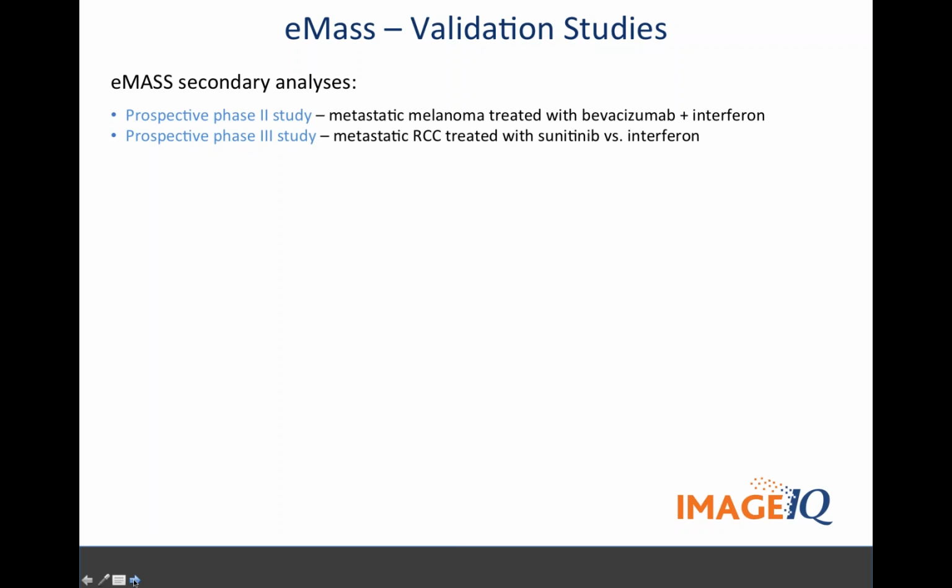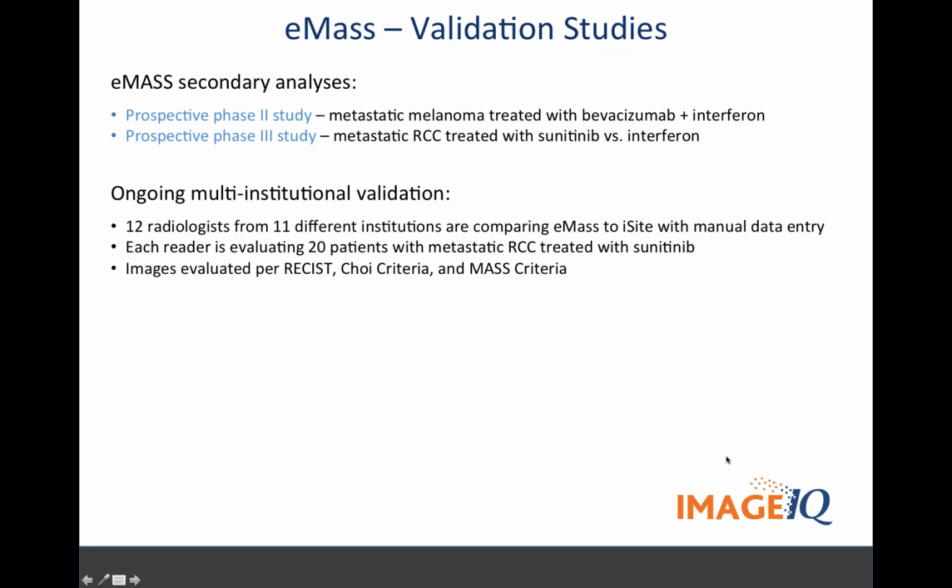We were able to do a secondary, retrospective analysis of that with our software and look at a number of different tumor metrics. That's where our vascular tumor burden really shines, very predictive of outcome. I would argue that's currently the best biomarker in existence for predicting response to anti-angiogenic therapy. But I'll let you read that when our manuscript gets published in Radiology, and you can make that decision for yourself. So we started there with the validation.